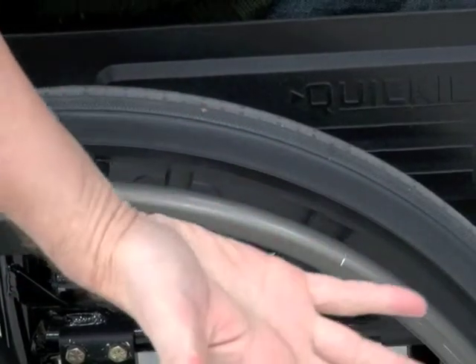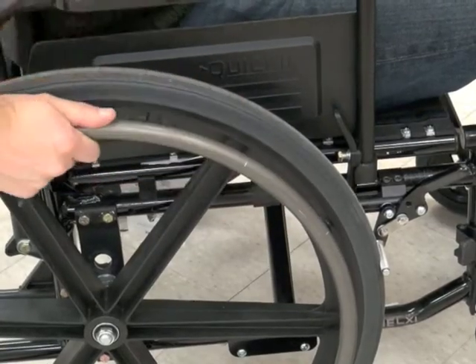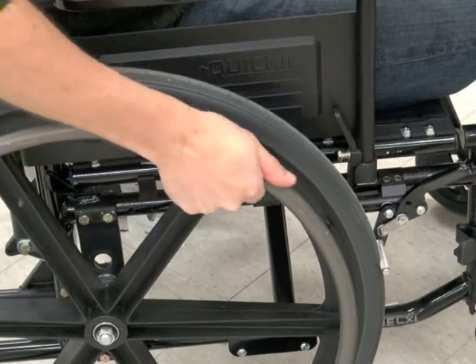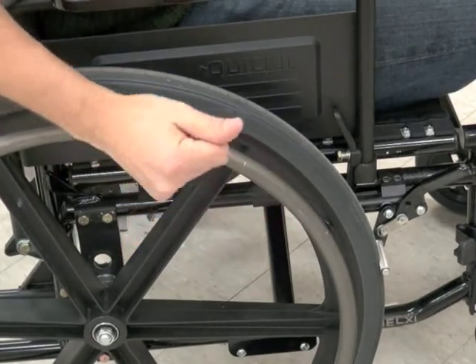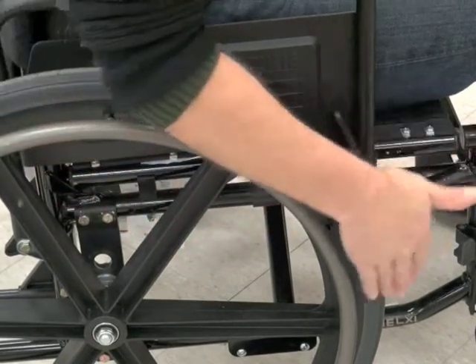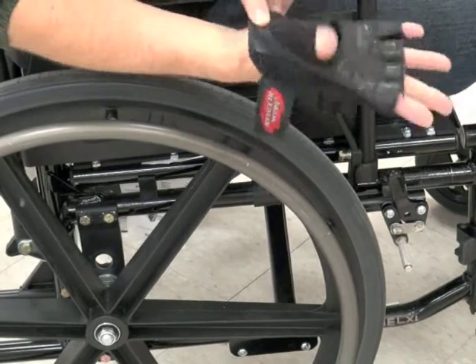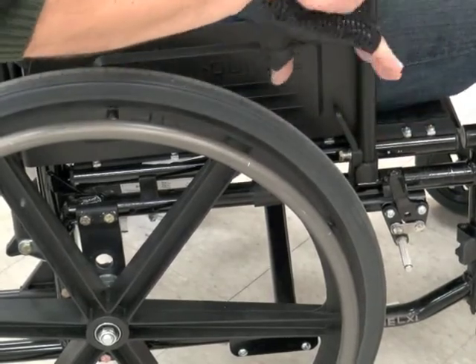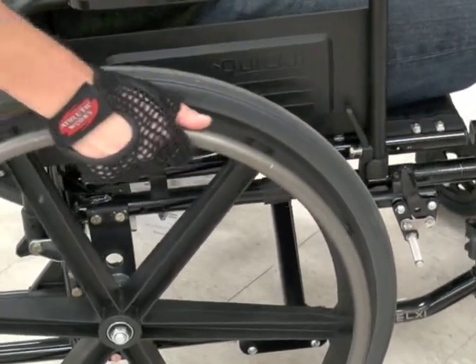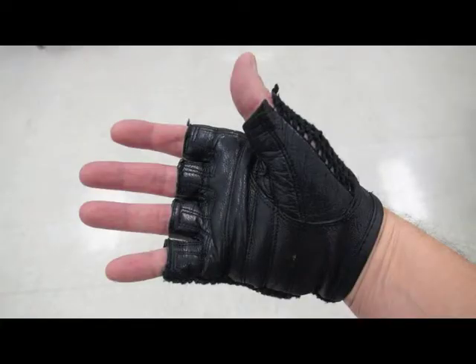Pushing and rubbing your hands on the push rim can create a variety of problems, including discomfort, bruising, abrasion, and friction burns. You should also be careful not to catch your fingers in the spokes or wheel locks on your wheelchair. One strategy is to wear fingerless gloves, which are typically available from your wheelchair vendor or from many sporting goods or departments. Weightlifting or cycling gloves are very similar and can be used effectively for wheelchair propulsion.